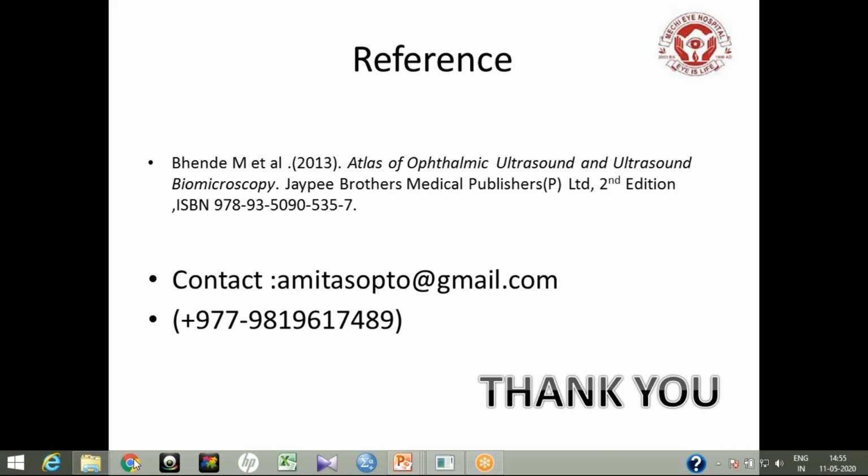Okay, so there is another question, sir. I guess we have answered this question. Okay, sir, can you go further on the intrinsic tumor vascularity question, or may I proceed with another question, sir? Yes. Okay, is there any difference between sweeping the probe over the lid and over the sclera?